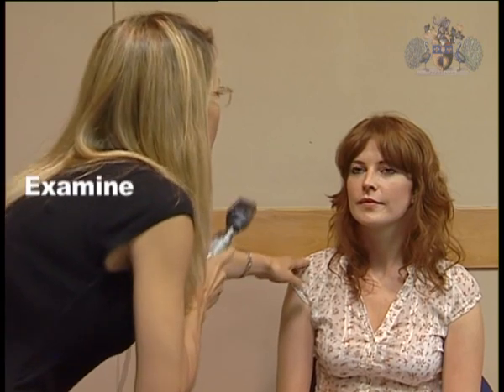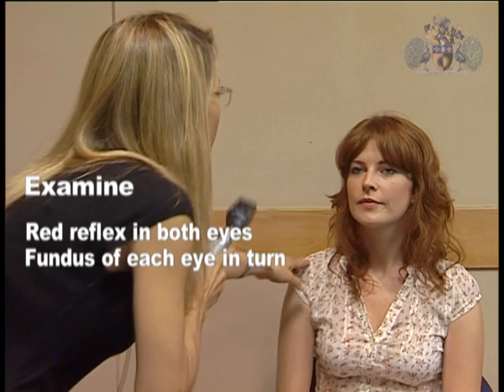Give the patient clear instructions. Please look into the distance at that wall, at that clock on the wall. You need to examine red reflex in both eyes at the beginning and then the fundus of each eye in turn.